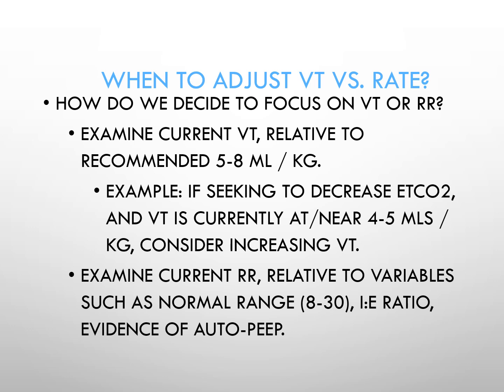Likewise, you examine the current respiratory rate relative to variables such as normal range, 8 or 10 to 30, and the I:E ratio. Is there any evidence of autoPEEP? Because if you go too high on the respiratory rate, you're taking time from exhalation, and there may be insufficient time for that patient to exhale fully. So you could be fixing one problem and maybe contributing to another. But where you have the respiratory rate at the lower end, let's say 12, 14, or 16, and the patient has a respiratory acidosis, particularly if the tidal volume is already fairly large, then work that respiratory rate.